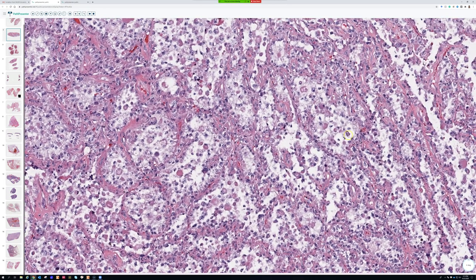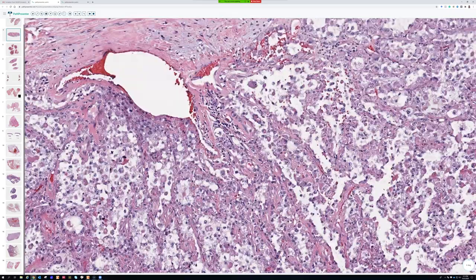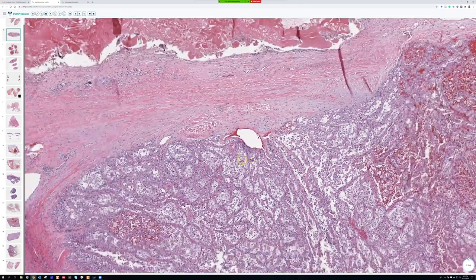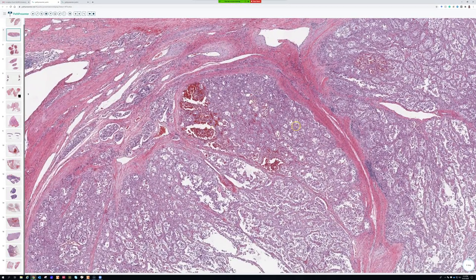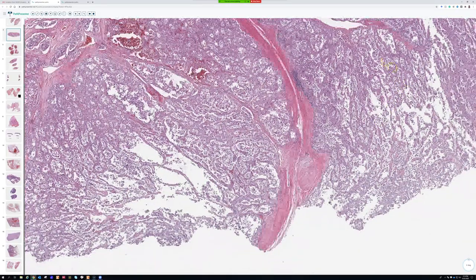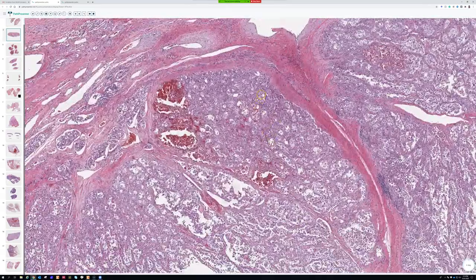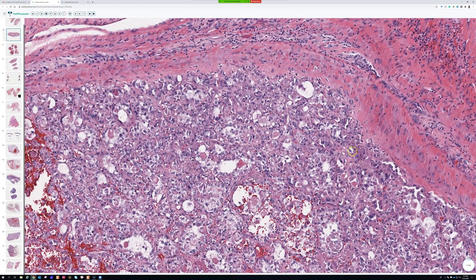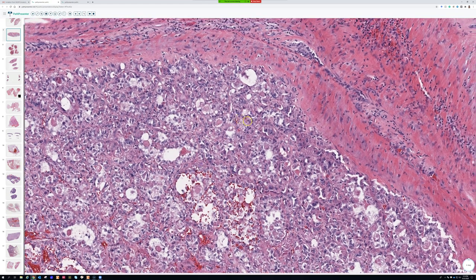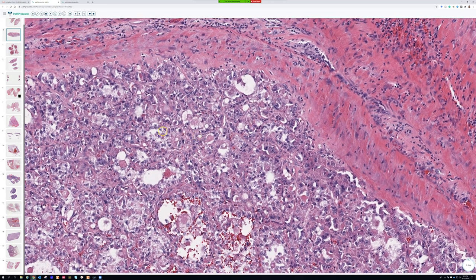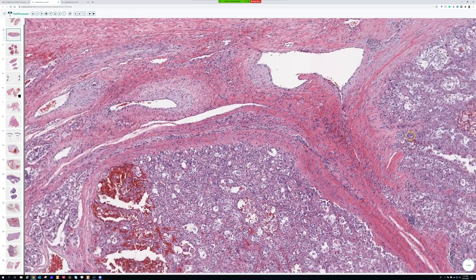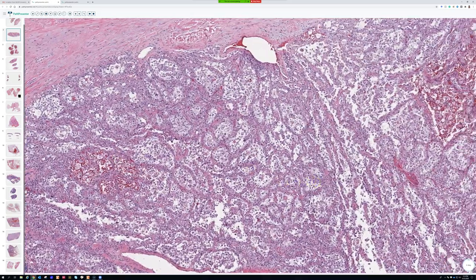I'm not sure what much else we'd think of for this, but let me show you one area I want you to see. This area is probably one no one paid attention to because this other stuff is much more interesting and more classic. But look at this area — it's kind of different. There are no alveoli here; instead there are these rounded epithelioid or almost rhabdoid cells arranged in multiple little clusters or nodules, almost a touch zellballen. When you see a tumor composed totally of stuff like this, you could think of paraganglioma. But when we also have the other pattern, I don't think paraganglioma would really be in the differential.